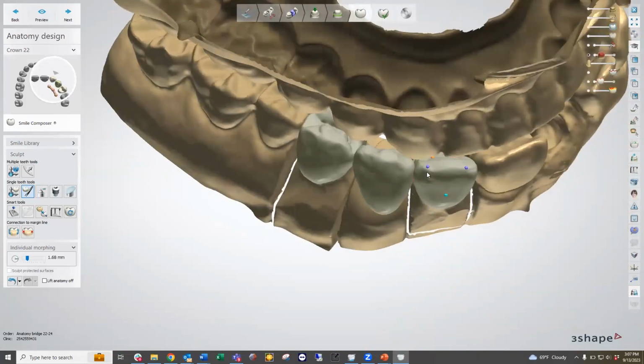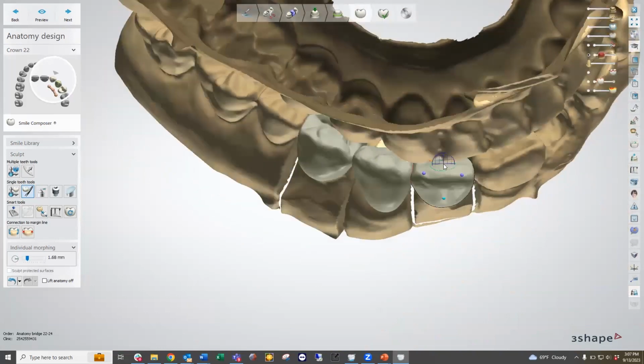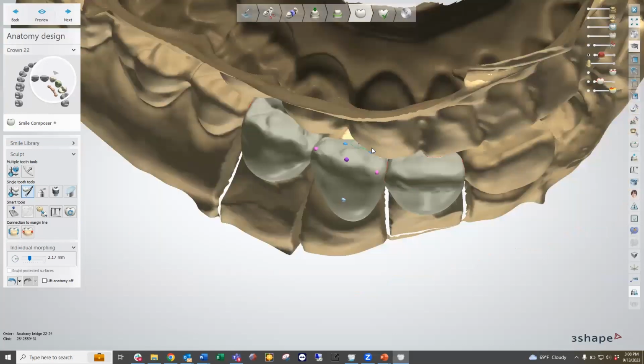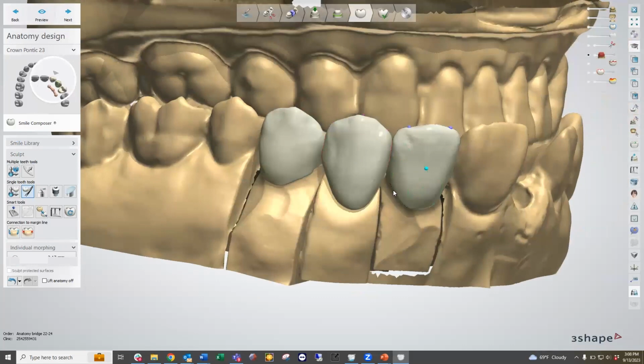And we can see that we're out of occlusion a certain amount. We do have an issue with our occlusion over here relative to our minimum thickness, but we're always going to allow that minimum thickness to take precedence. You never want to mill something out without the minimum thickness being met, because then you run the risk of running into milling out holes or issues with the strength relative to that certain area. So we're going to go ahead and say that this is good to go.